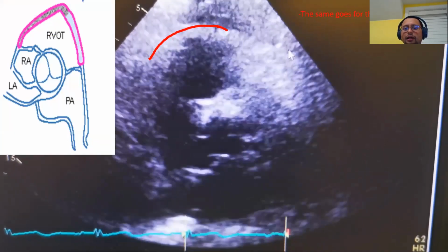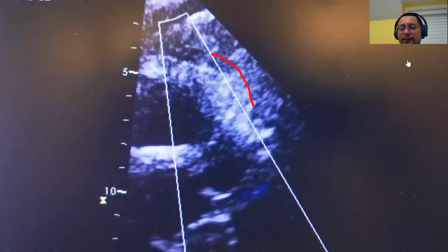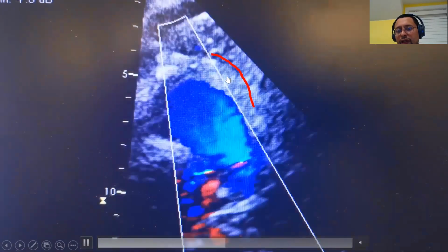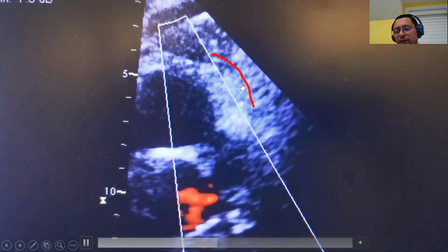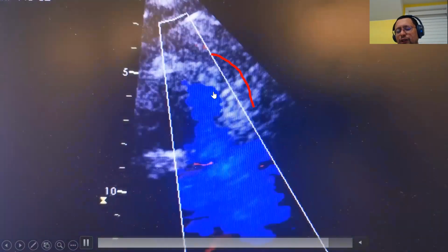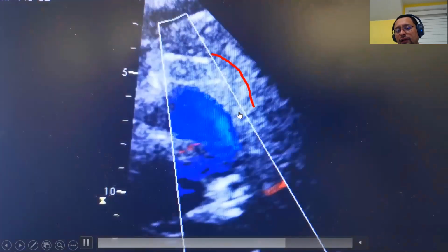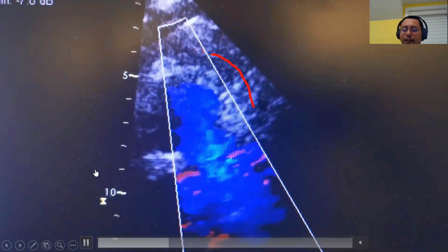Okay. So just last one as a bonus, I just wanted to show you, slightly proximal to the pulmonary artery here, that is the right ventricular outflow tract wall. This wall is actually supplied by the conus branch of the right coronary artery. Unless you have a blockage at the ostium of the right coronary artery, usually the right ventricular outflow tract portion is not involved.